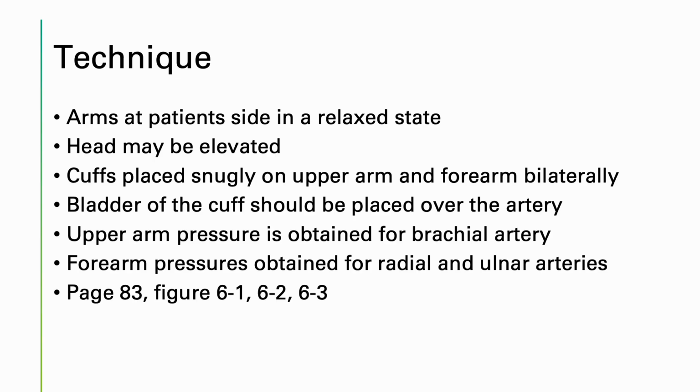Same position as the legs. Arms are going to be by the patient's side, relaxed. Head may be slightly elevated. I'm okay with you guys coming up a little bit on an angle, but a real patient should really be laying down flat. You're going to place the cuff snug on the upper arm and forearm. The bladder of the cuff should be placed over the artery, just like on our legs.